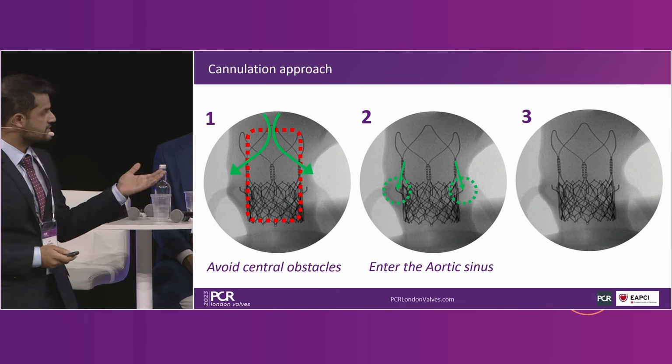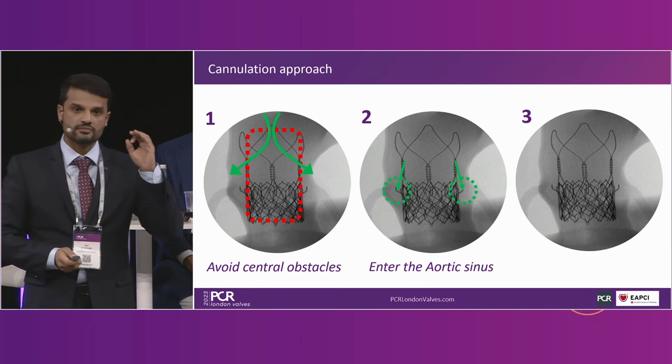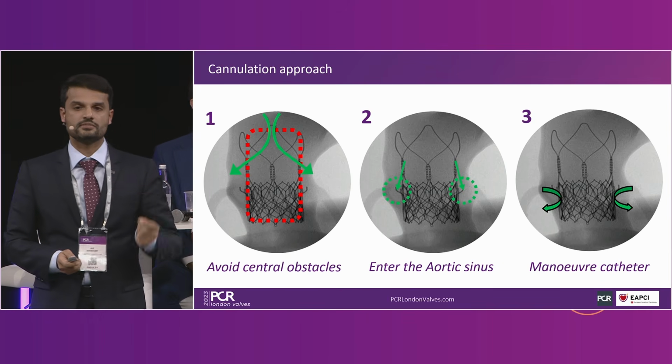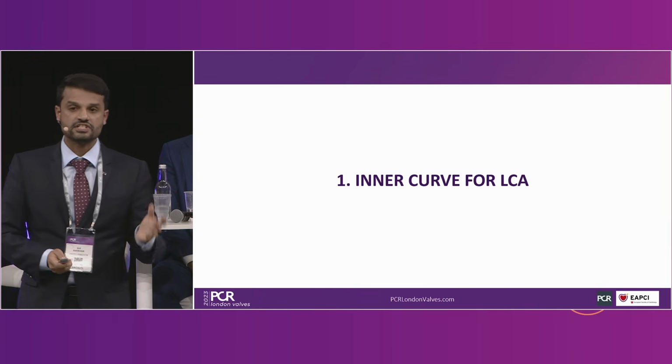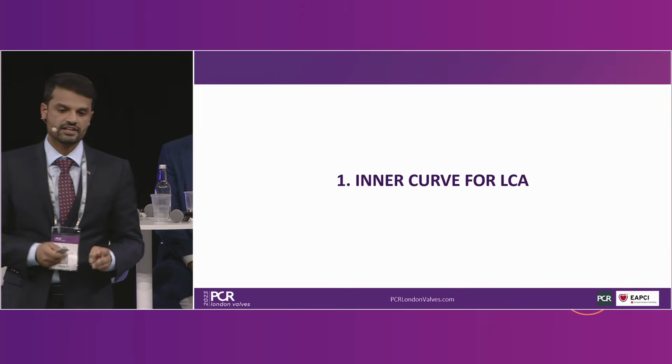Then, we mentioned the sinotubular junction. It really is the bottleneck for coronary access. You need to be able to cross the sinotubular junction, but then you also need enough space to be able to rotate your catheters. So sticking with that approach, I'm going to present to you 3 different techniques and then a couple of other concepts.